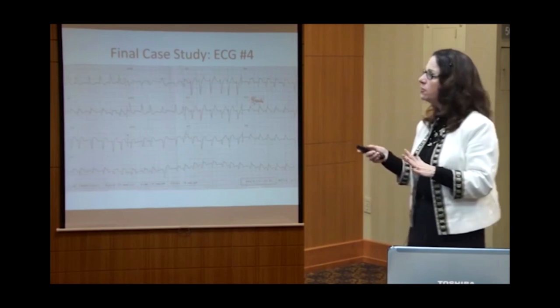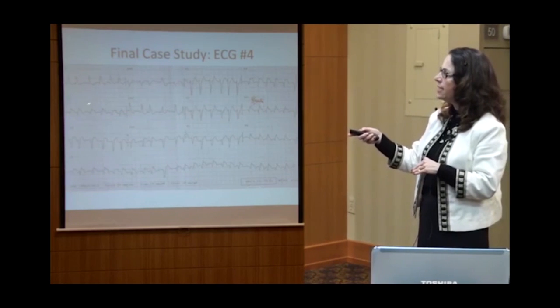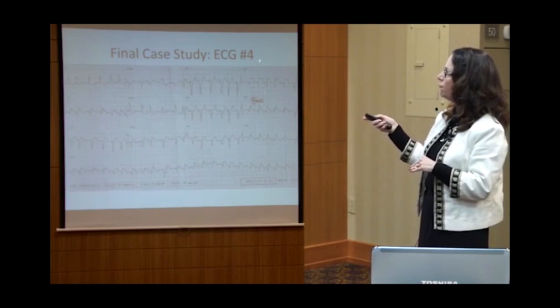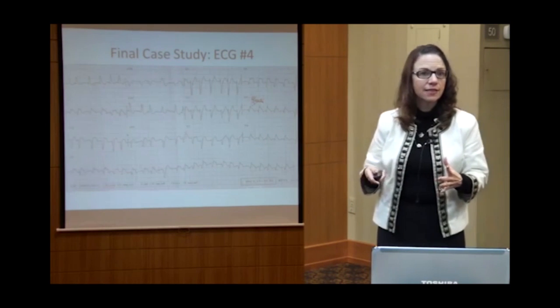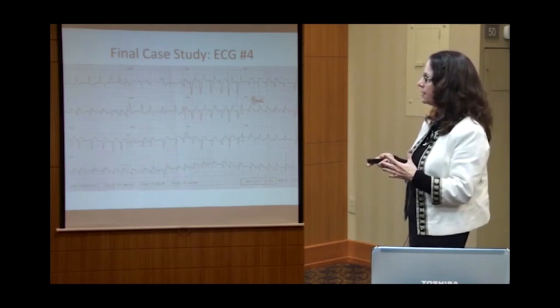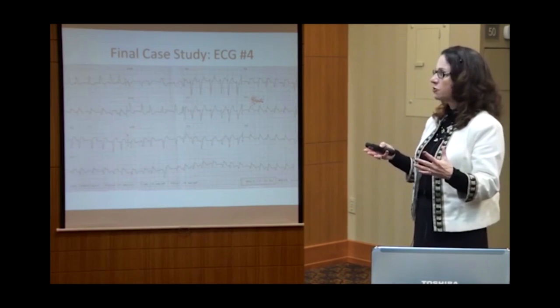It's 3:30. So we do this ECG. Look at this. T waves are back upright. Lead 2, lead 3, AVF, V4, V5, V6. So we call the interventionalist. We said, hey, it looks like this guy's reoccluded his coronary artery. Looks like he's reinfarcting, and he's gone into atrial fib as a result.